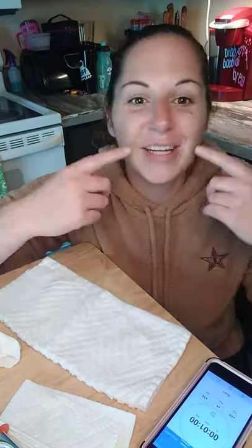And as you know, your denture gets a little loose because our gums are going to shrink. They do have snug-up applications, and you can get another upper or another lower. This was just for uppers, but you can just do a touch-up. You already have Denture Fit on it, the silicone, so you just have to add to the silicone. You do not need to prime again, which is awesome.